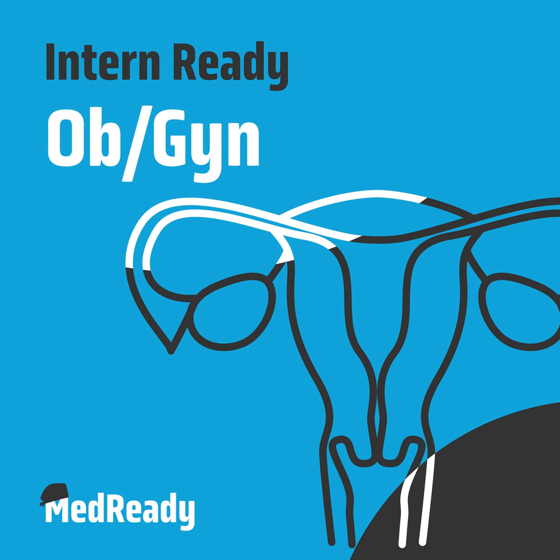You tell patients, of course, that if they do have a perforation, sometimes nothing else actually needs to be done, and it can heal on its own. But there is always the risk that we would need to make smaller incisions in their belly and look down with a camera from up top in order to look deeper. Great. So what are the components of a hysteroscope?